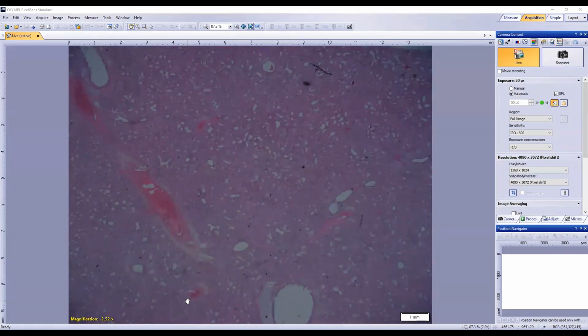Then we need to move towards the blood vessels. So look at the tunica media, whether it has been infiltrated with some sort of inflammatory cells or it has been discontinued. We need to look carefully if there is any specific endothelium damage or not. So we are looking actually for vasculitis, if there is any.